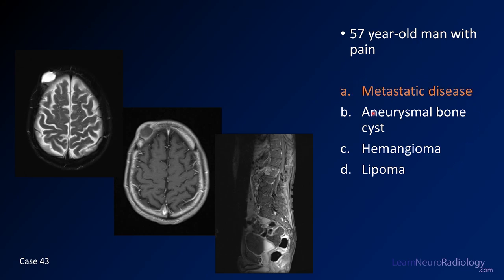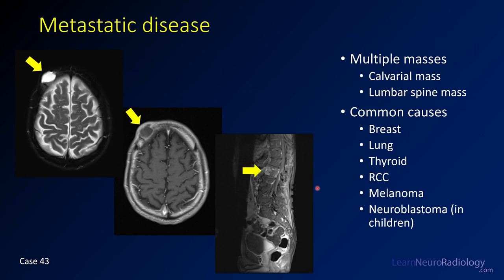This is a case of metastatic disease. The fact that you have spine imaging along with head imaging was a clue. What you have is a T2 hyperintense lesion in the anterior calvarium with a little peripheral enhancement and nodularity, plus bone destruction. It's not a lipoma because it doesn't suppress on fat-suppressed imaging. In conjunction with a mass in the lumbar spine vertebral body, you have to be thinking about metastatic disease.